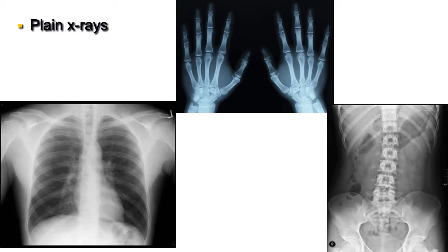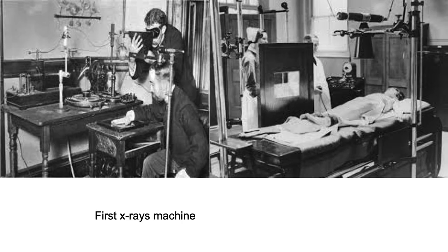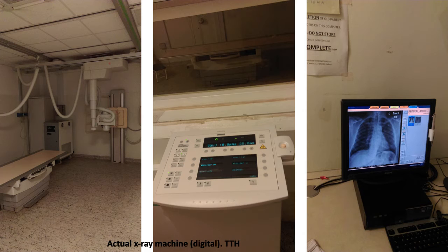Moving on, these are samples of the story of the development of the X-ray. You can see this early machine from the beginning of the 19th century. Then we have these new digital machines with very good image quality and low ionizing radiation dose.